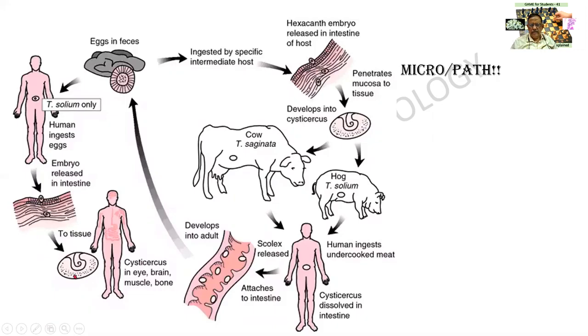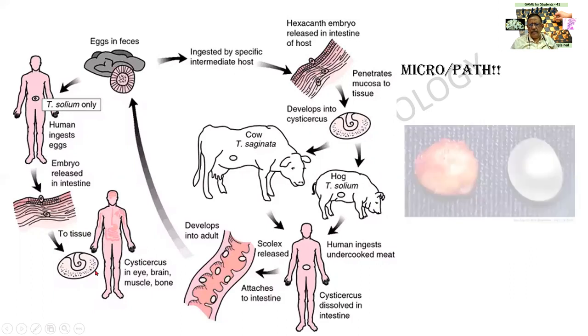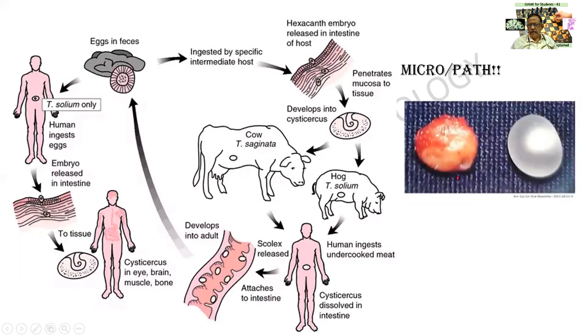It encircles itself in a very thick walled cyst, and there is an invagination. This is exactly what we will be seeing either in the subcutaneous region or in the parenchyma or the muscle, etc. Look at this. So the outer pericyst has been removed and the inner cyst is somewhat translucent with invagination. Many a great person has been diagnosed with brain tumor, but ultimately it turned out to be a case of cysticercosis. See you in game 42.